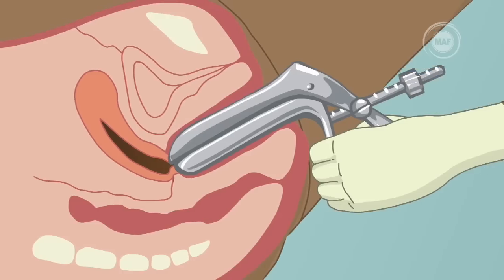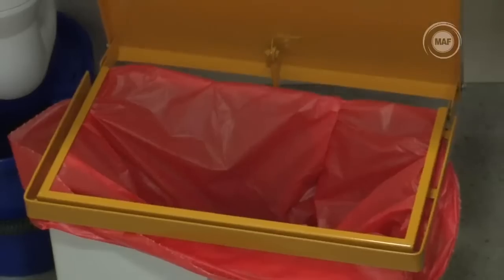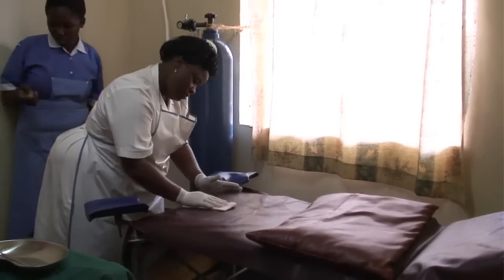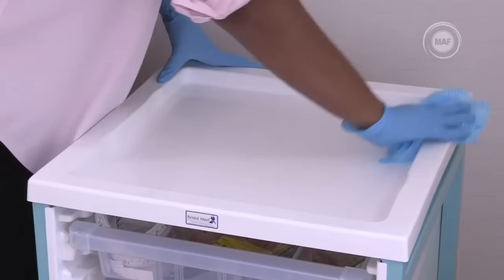Once you have finished your observations, withdraw the speculum gently. You should then dispose of all contaminated swabs, gauze, and other waste material into a plastic bag, in a plastic bucket, or a clinical waste bin. Gloves should be decontaminated by soaking in 0.5% chlorine. It is also important that you wipe down any surfaces that may have been contaminated with blood or body fluids with chlorine solution. The floor should also be cleaned daily.